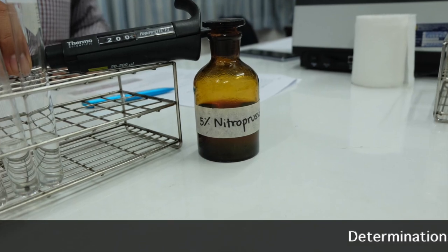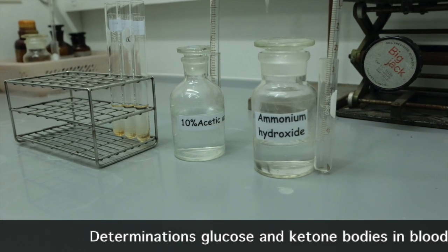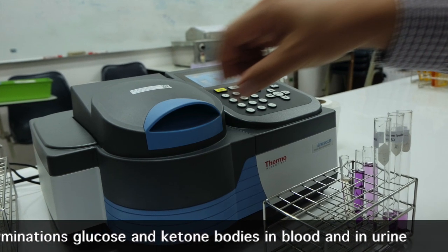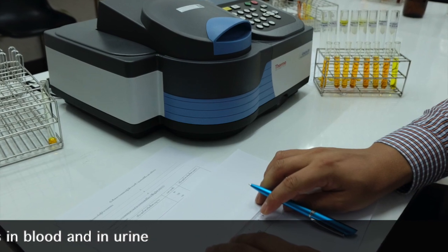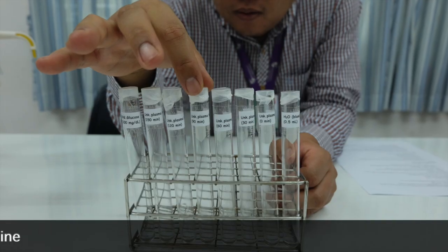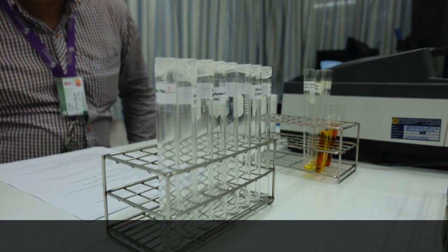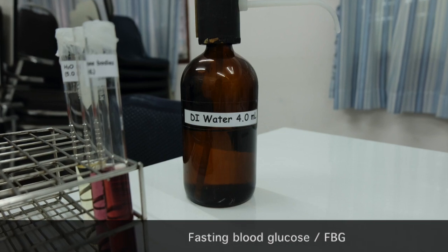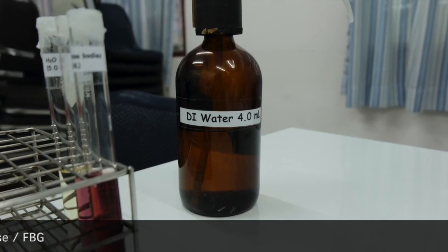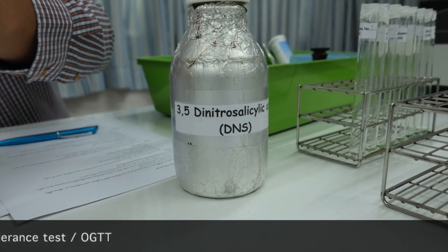Metabolism and energy experiment. In this experiment chapter, you measure serum glucose and serum ketone bodies along with their levels found in urine. These two parameters could potentially refer to the metabolic state of individuals. Determination of blood glucose could be done by single determination from the fasting blood, so-called fasting blood glucose, or FBG, and oral glucose tolerance test, or OGTT.